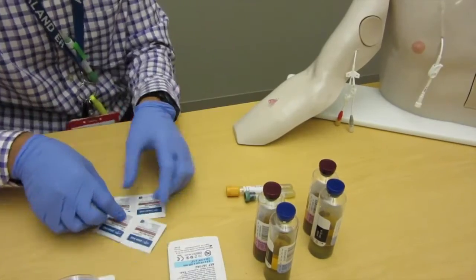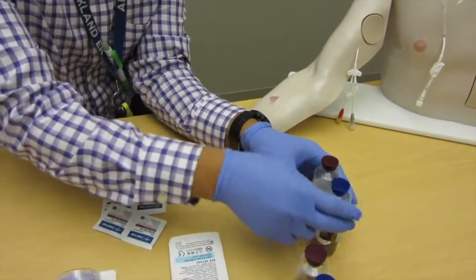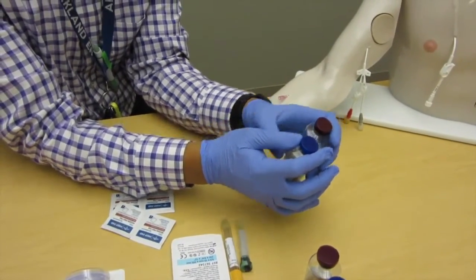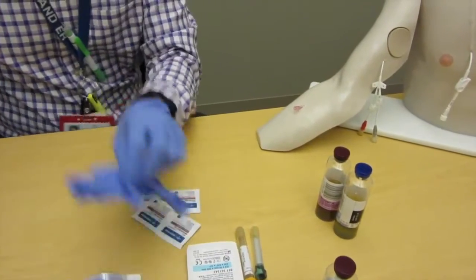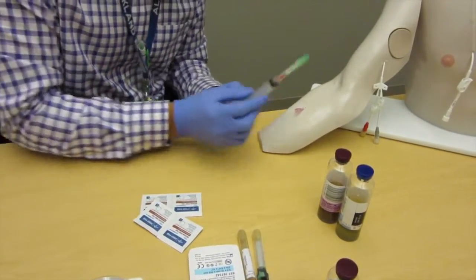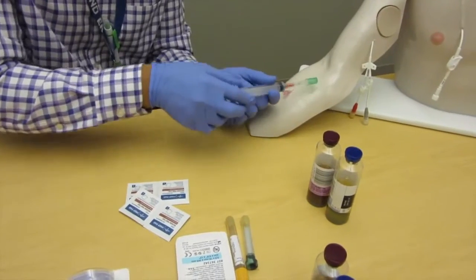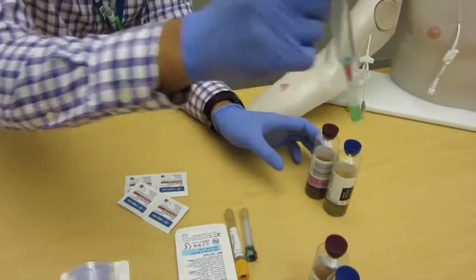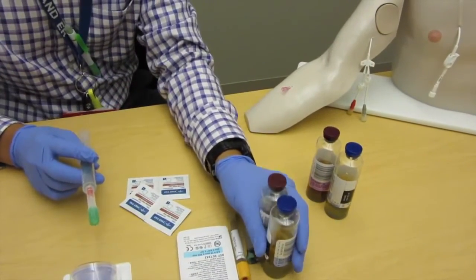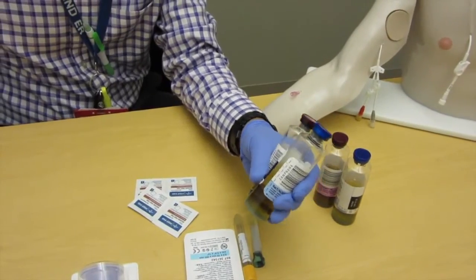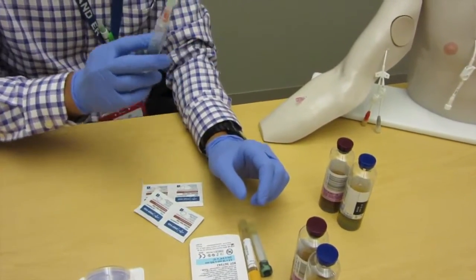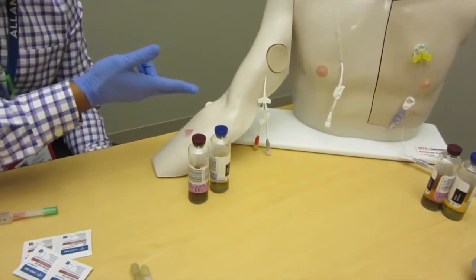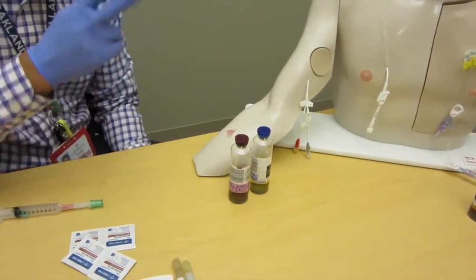Another thing you want to do: two sets of cultures means two sets of cultures from two different sites. One improper technique is some people get one sample from one site and then split it into two different samples—anaerobic and aerobic. You want to get it from two different sites. If you get one from your right arm, get the other one from the left arm. You can also do it 10 minutes later on the same arm, but just make sure it is two different collections, not one collection split into two sets.